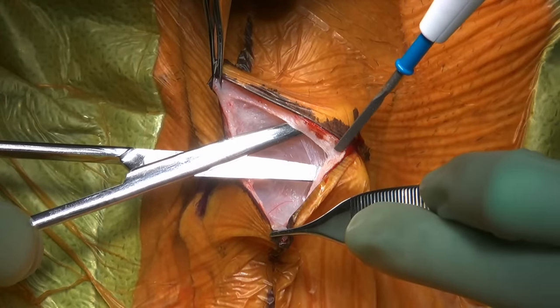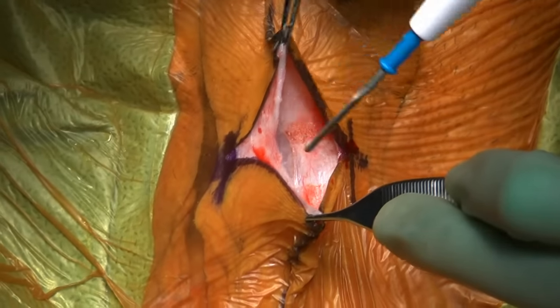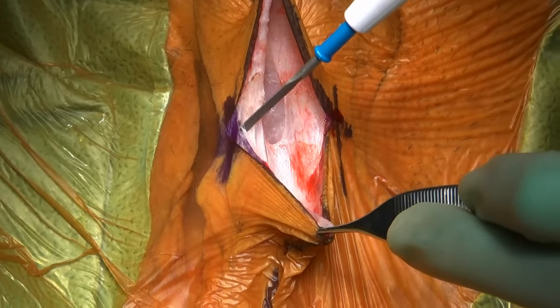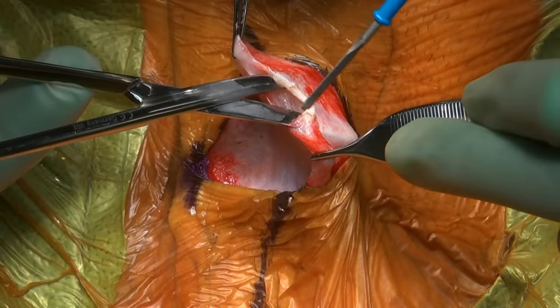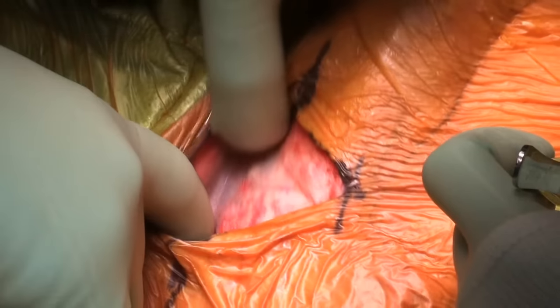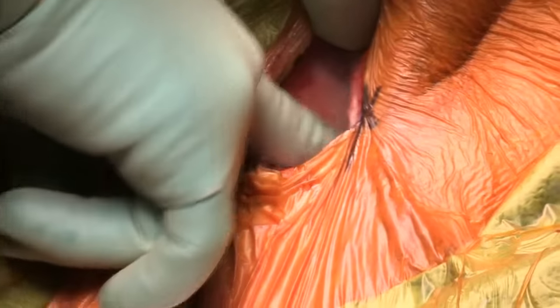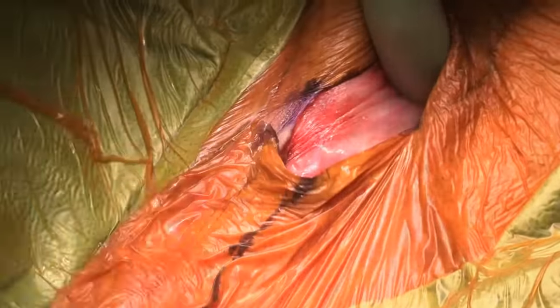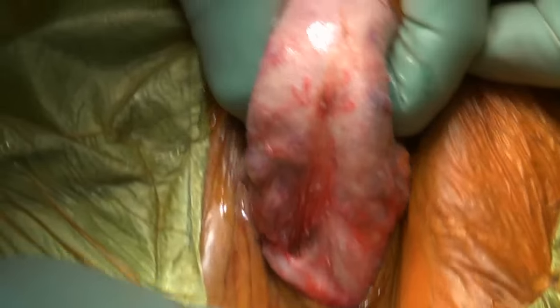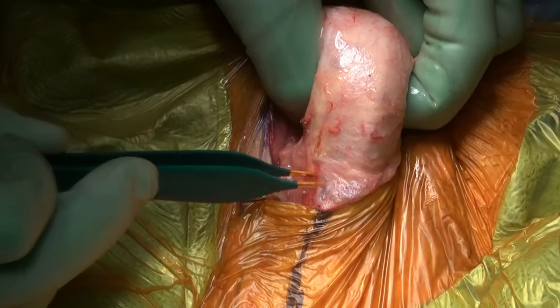Identification of appropriate tissue planes makes the dissection easy, and we only divide necessary tissue to avoid postoperative swelling and pain. The scrotal contents are pushed down with gentle blunt dissection. The penis is then elevated out of the wound on gentle stretch, and any remaining crossing veins or connective tissue may be dissected caudally.